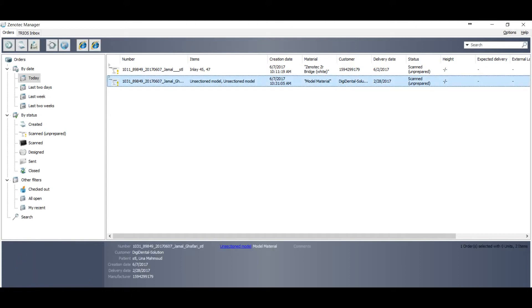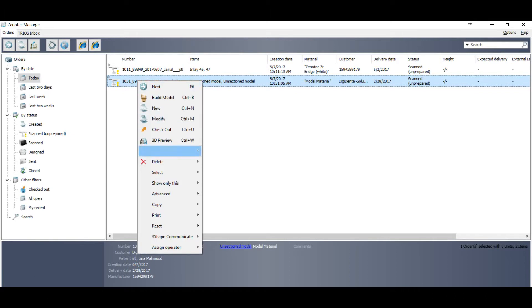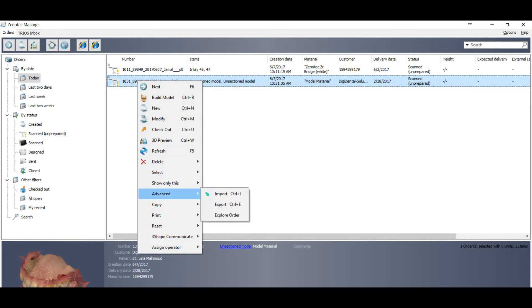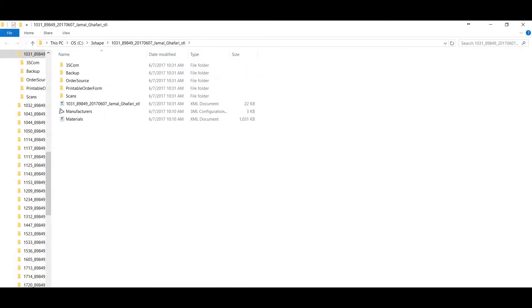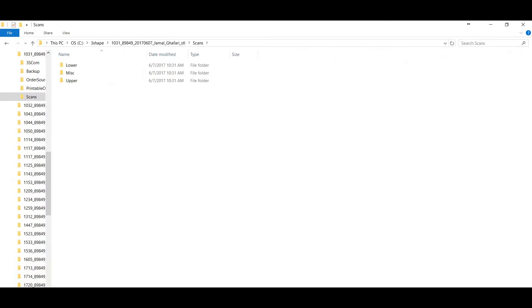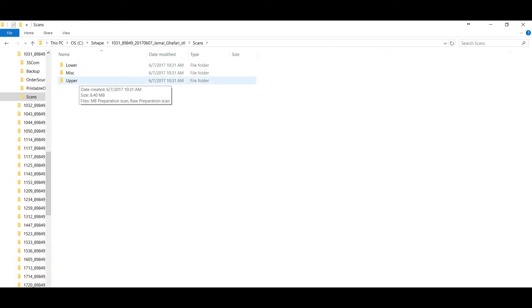We have an order here. The doctor has selected this one as a digital model. Just select this order, right-click, go to Advanced, then go to Explore Order. You will find the data of the order. Now go to the Scans folder. In the scans, you will find all the files — upper and lower scan data.